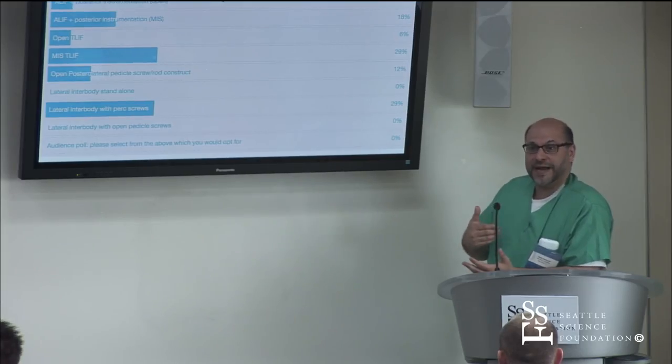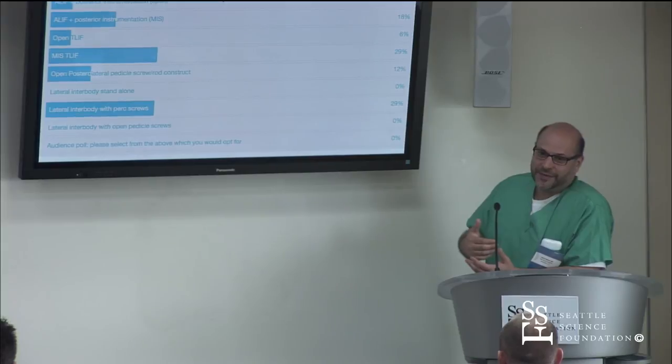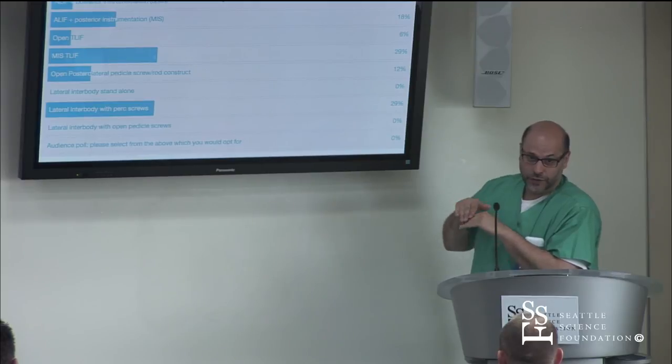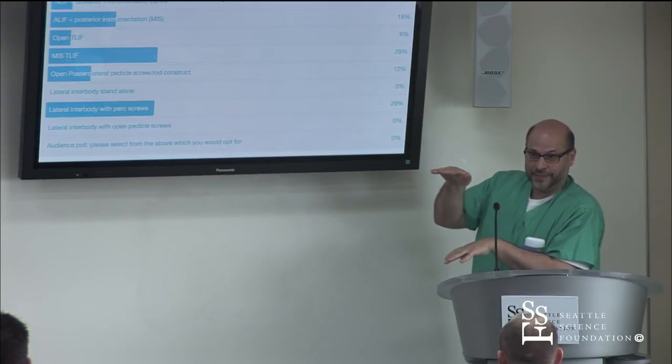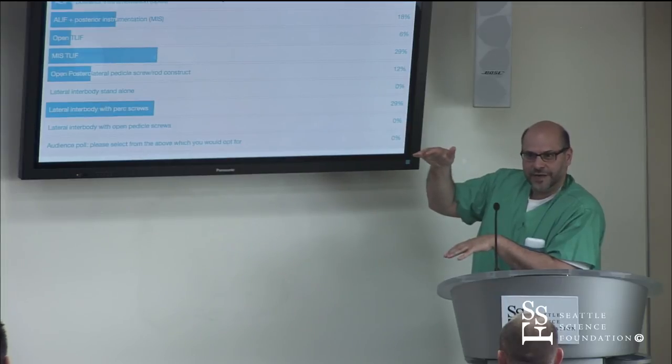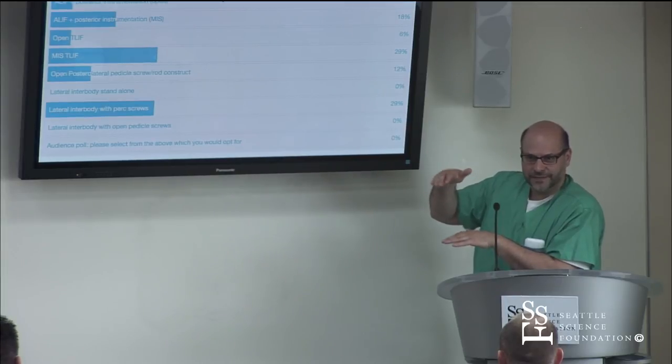You're going to take the pressure off the back of it. Pressure on the back of it's not the problem. It's the north-south diameter of the foramen that's the problem. So if you don't get into that interbody and really jack it up and open that foramen how it used to be, she may still have a problem. Right? Does that make sense?